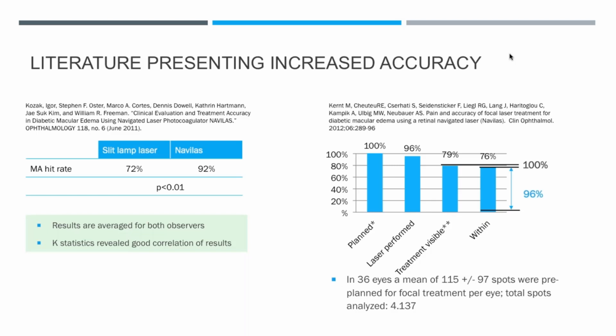And in addition to that, the completeness of treatment is higher when using pre-planned photocoagulation as opposed to the ad hoc conventional slit lamp approach.